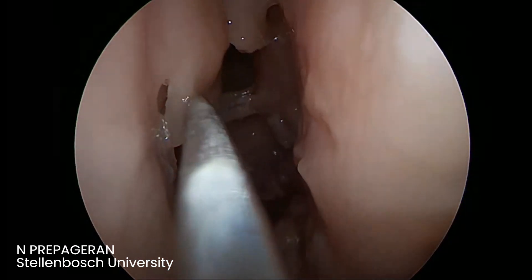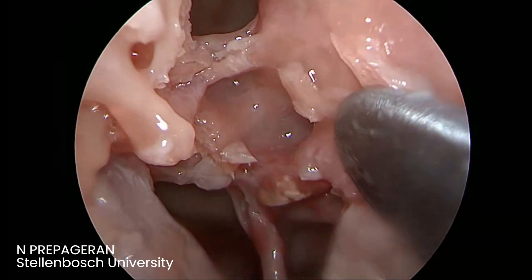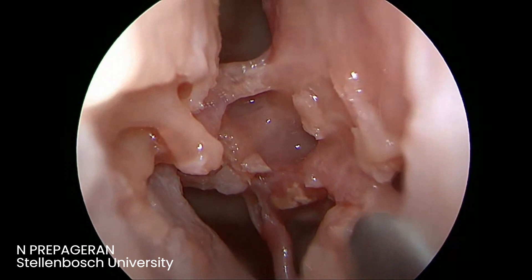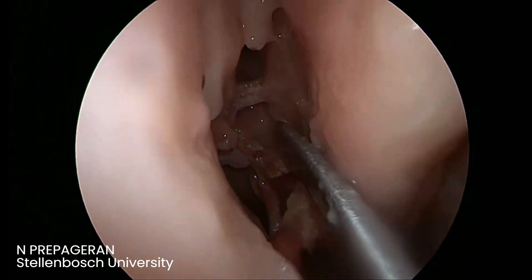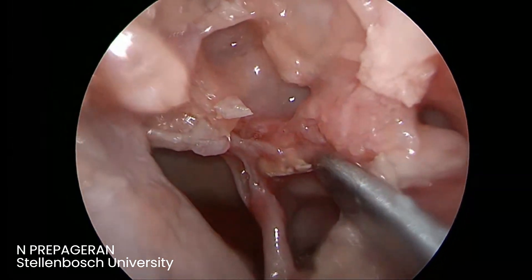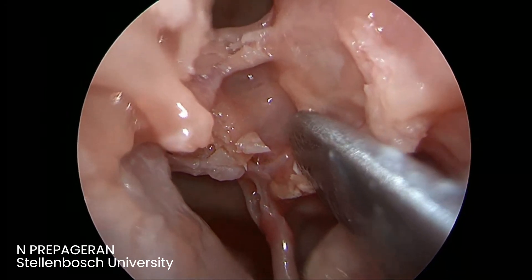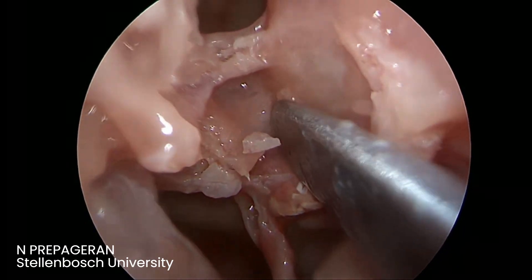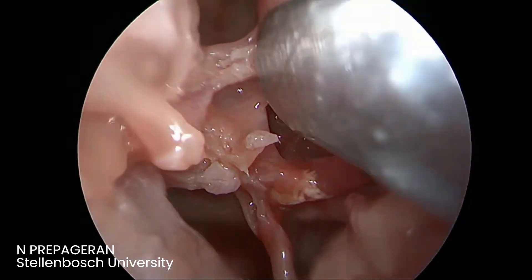Next is the ground lamella. Gate number one was the uncinate. Gate number two was the bulla. Gate number three is the ground lamella. Can you see how the middle turbinate turns laterally here? That's the ground lamella. The ground lamella has a vertical component and a horizontal component. You want to preserve the horizontal component as much as possible, because that will be perfect for drainage. What I do is always go at the junction of the middle turbinate at the vertical and the horizontal.